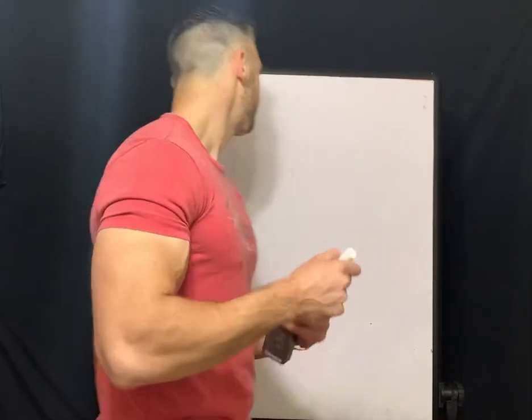So sometimes with the contact lens prescription, we may need to tighten the lens, or we may need to loosen the lens. And one of the ways you can do that is by adjusting the base curve. But when you adjust the base curve of a gas permeable lens, it's going to affect the tear lens, the lacrimal lens that rests between the back surface of the contact lens and your cornea. So we know that that space will fill in with the tear film, and it creates a lens. So before we go to the example, I want to draw some illustrations to help make this point stand out.